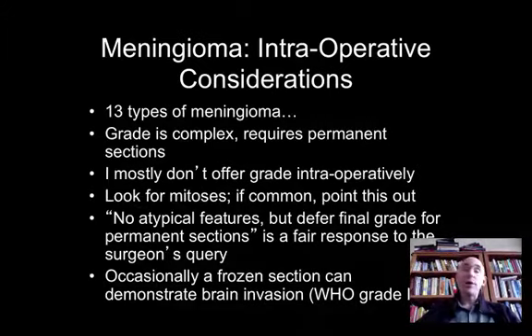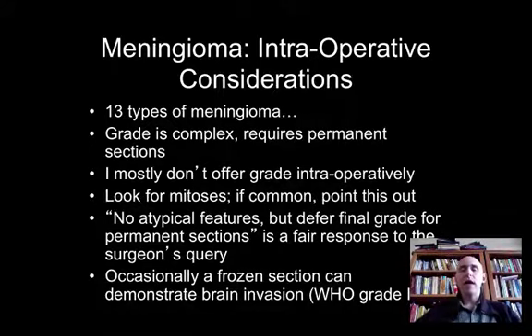Now, meningioma has a ton of different patterns, and it's usually not worthwhile to make those distinctions on cytologic preparation. Grading is complex and also is fraught with peril when you have a very small sample of a larger lesion. So I don't recommend typing meningioma, nor do I recommend grading meningioma intraoperatively. If asked, I think it's okay to say, well, I do see or I don't see atypical features, but then know something about what those atypical features are.